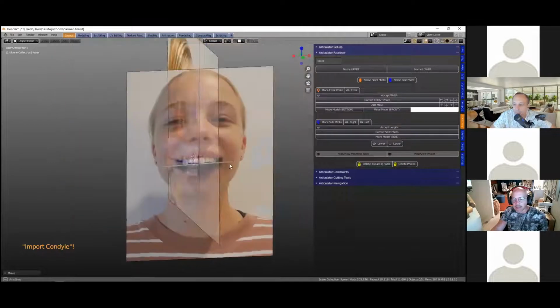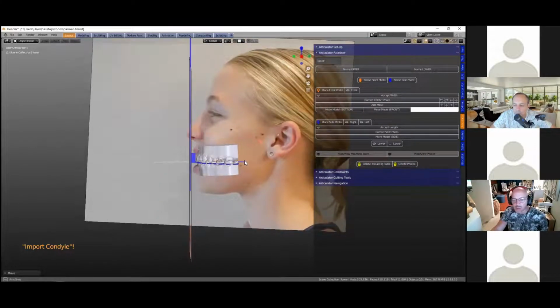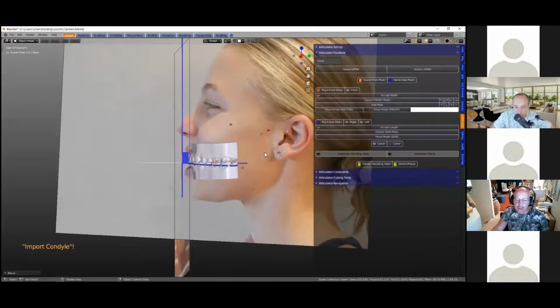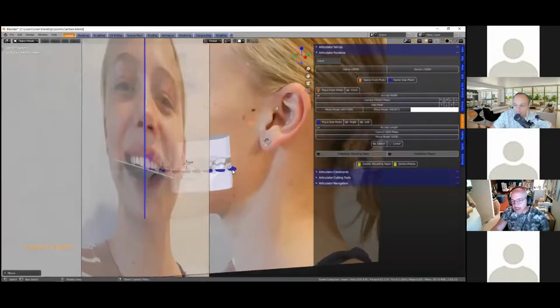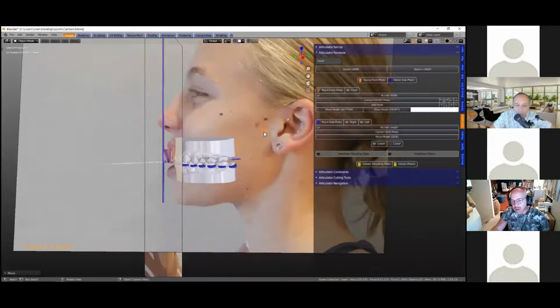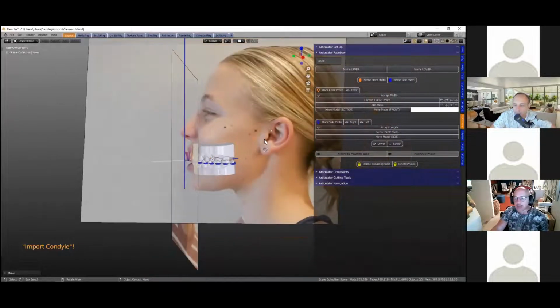And if we would now place the condyles, which we're then going to do, we know that this is where the TMJ joint is, more or less. So we can make a marking on the patient's face there as well. Did you make this marking? I'm not sure. I presumed you took them, but I can't remember. I may have marked it, but you can actually make a cross on the patient's face or make a little mark or something, and that'll help you as well.